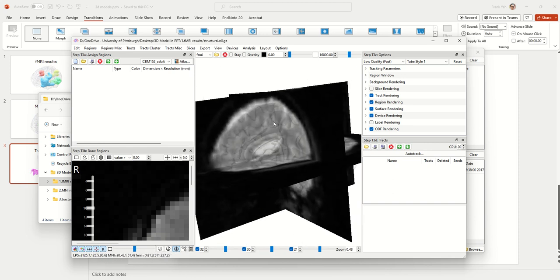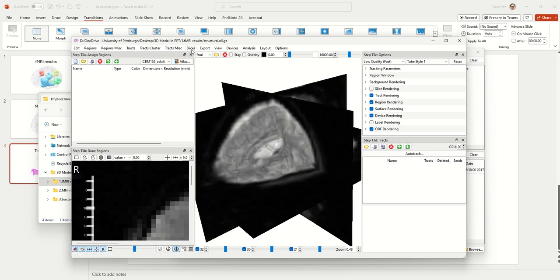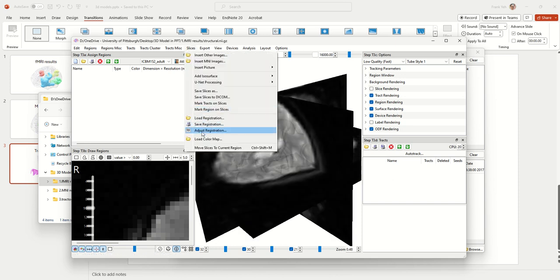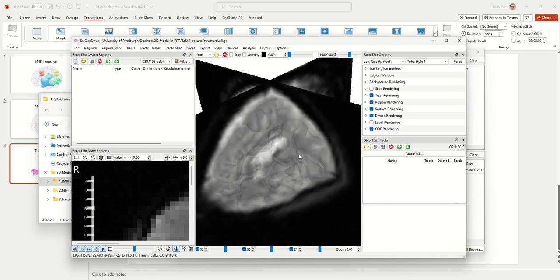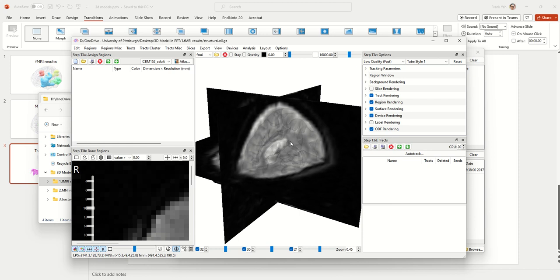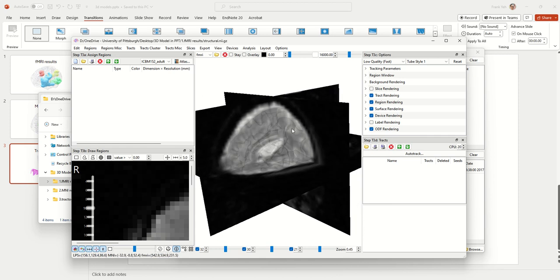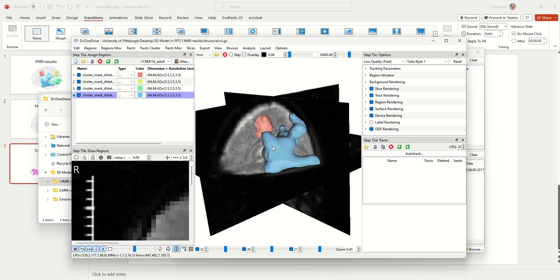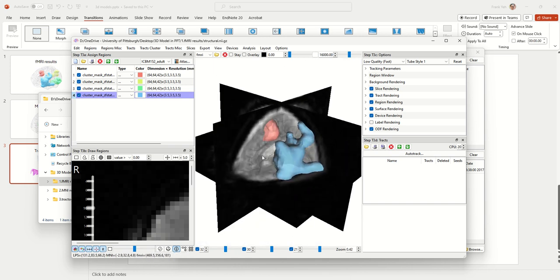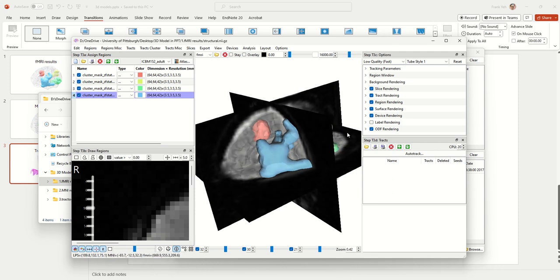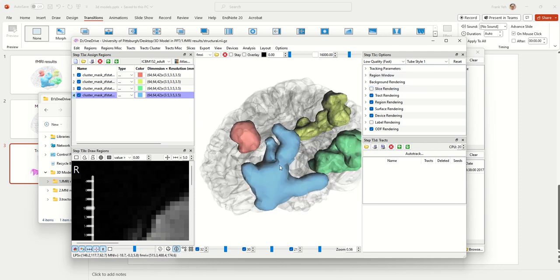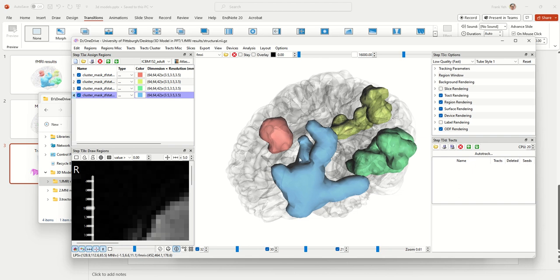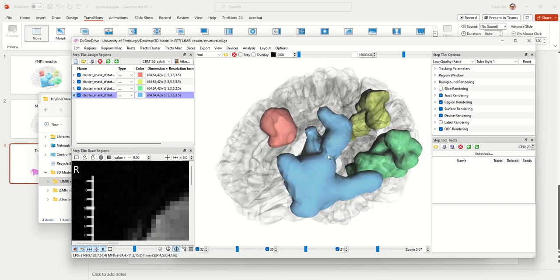If the alignment is not good, you can manually adjust it using the Adjust Registration function. Once the raw functional MRI data is loaded, DSS Studio has the reference between the T1 and the functional MRI space, and therefore we can now open the region of the cluster. Previously it was not able to do so because there was no link between the native functional space and the native T1 space. Now everything is loaded and you can see the ISO surface and the regions appearing.